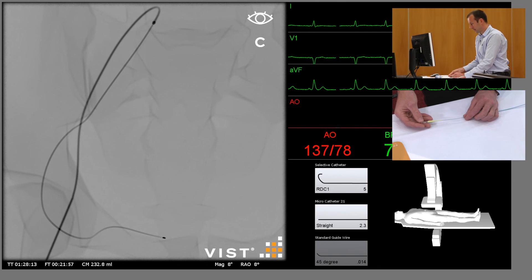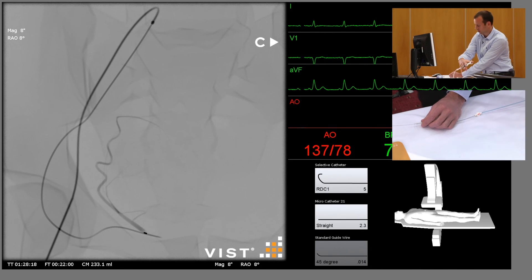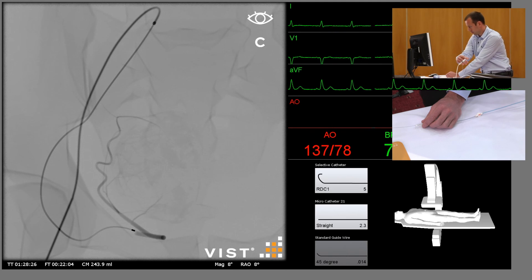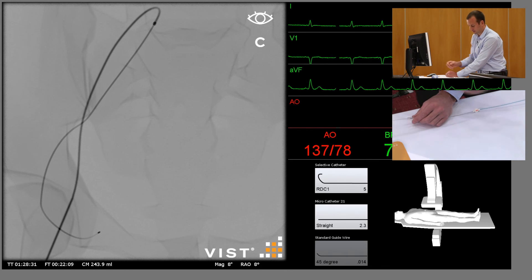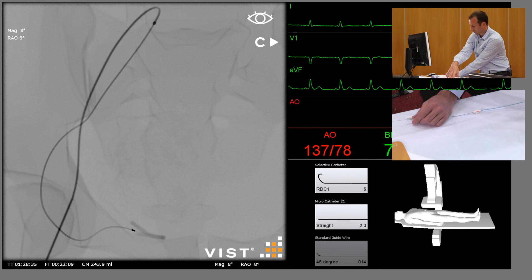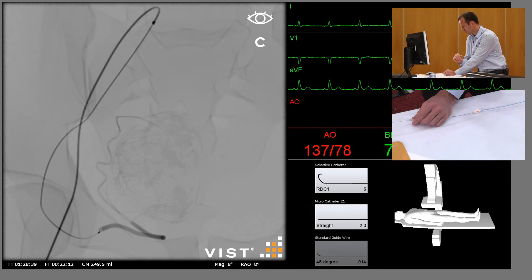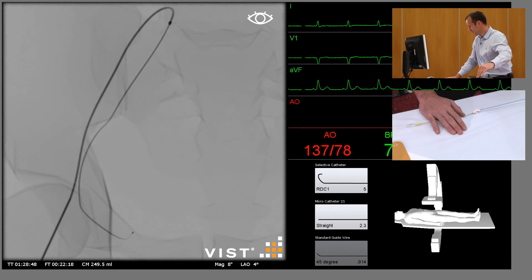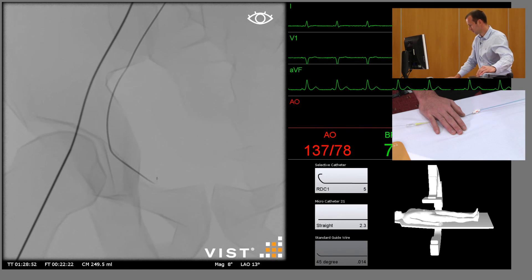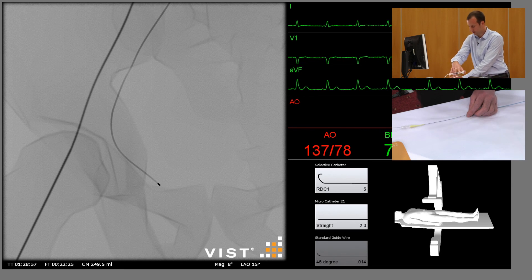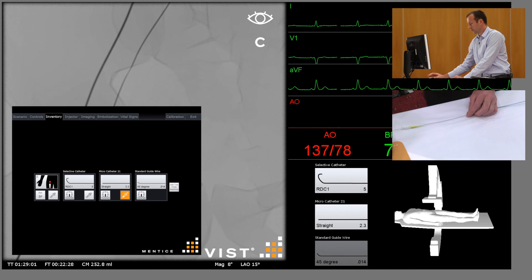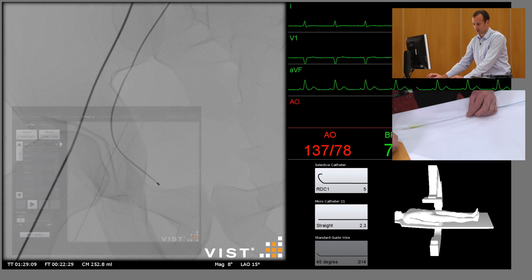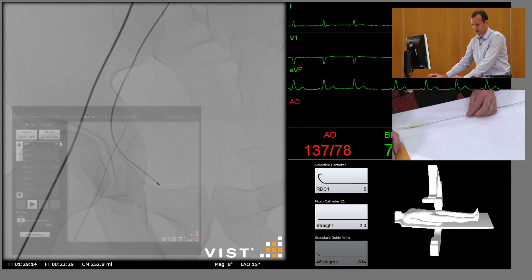It's worth pointing out that if we come back a little and inject here — perhaps a little further — this is the reason for passing the micro catheter much more distally: you can see the difference in the coverage of the target vessels.